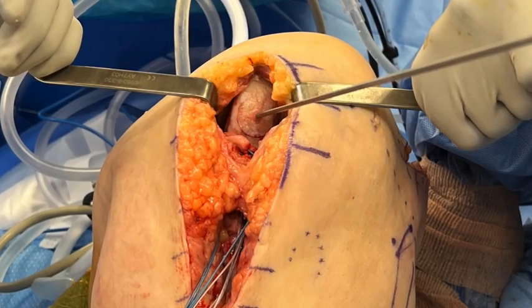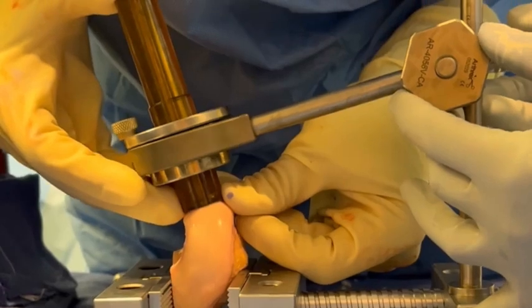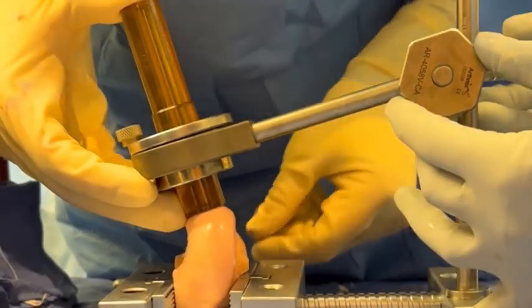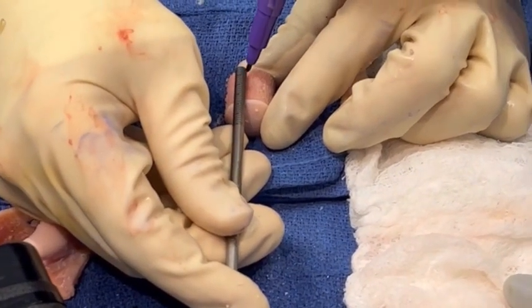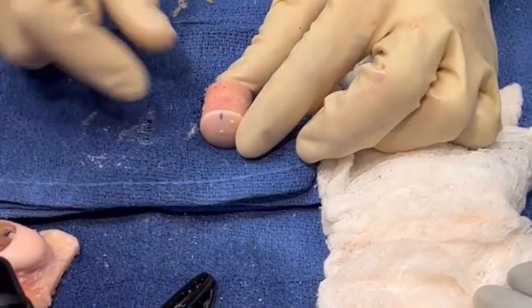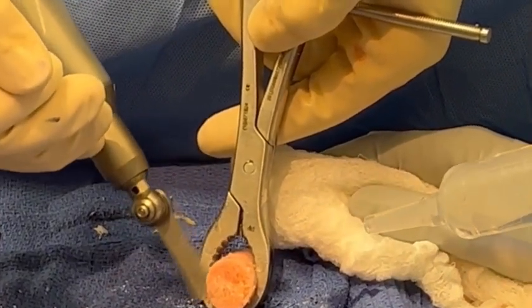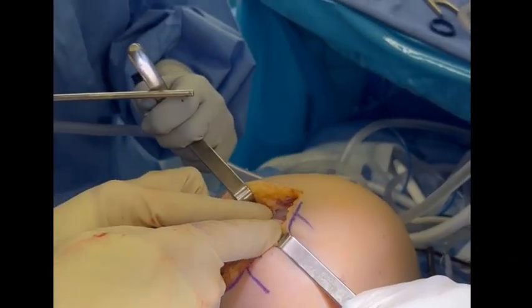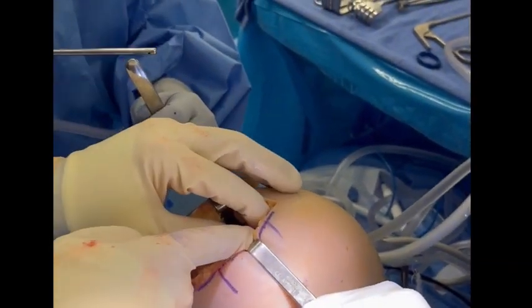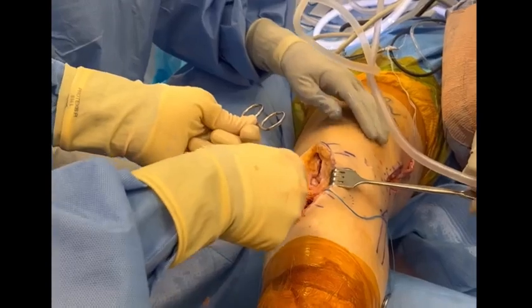This is reamed to a depth of 15 mm. At the back table, a fresh osteochondral allograft is prepared with the corresponding 20 mm plug taken and prepared using a sagittal saw. Subsequently, the press fit plug measuring 20.5 mm is inserted using digital pressure, followed by light protected use of a mallet for excellent press fit fixation, and the knee is ranged to ensure the graft is adequately positioned.